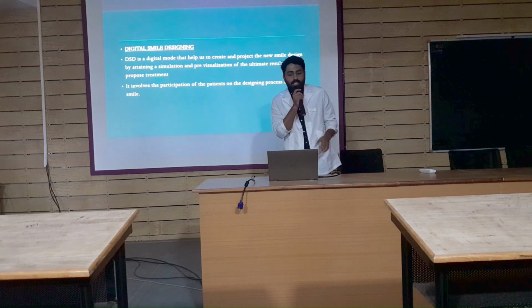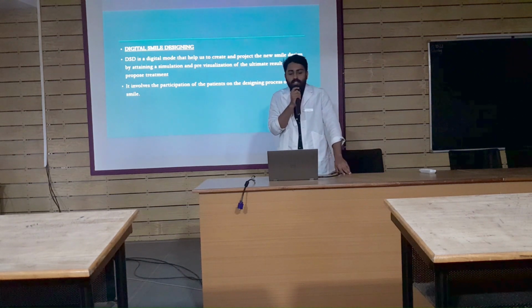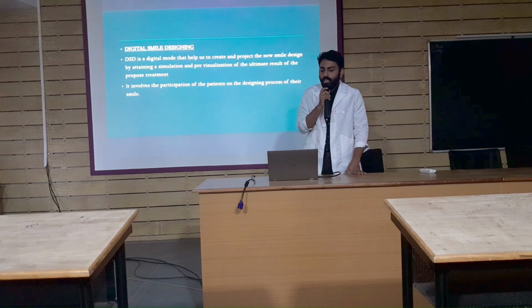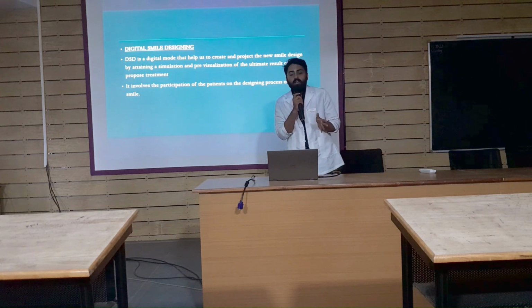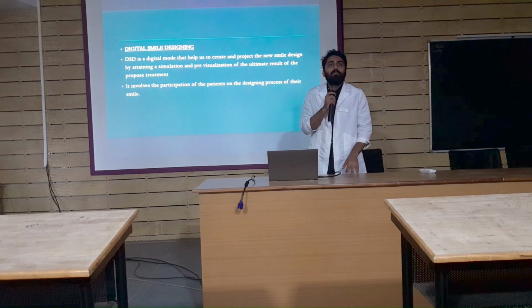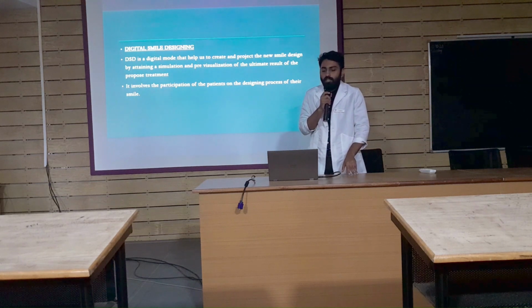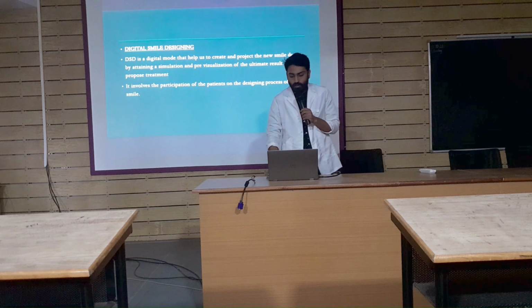We have digital smile designing or DSD. It's a digital mode that helps us to create and project the new smile design by attaining a simulation and pre-visualization of the ultimate result of the proposed treatment. We can digitally create the smile of the patient. We can understand what the future result of the treatment will be. It involves the participation of the patient in the designing process of their smile.